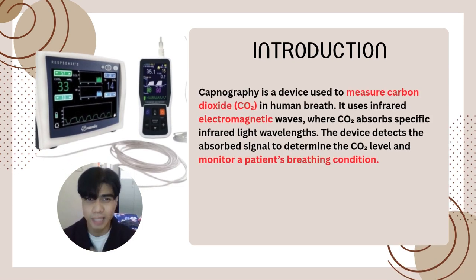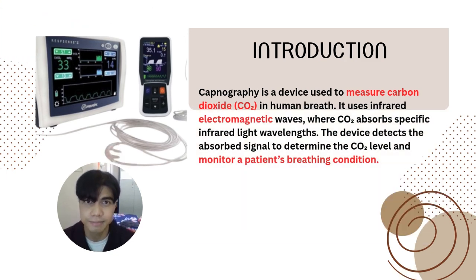Okay, so what is capnography? Capnography is a device that is used to measure the carbon dioxide in human breath. It uses infrared electromagnetic waves, where the carbon dioxide absorbs specific infrared light wavelengths. This device will detect the absorbed signal to determine the carbon dioxide level and monitor a patient's breathing condition.